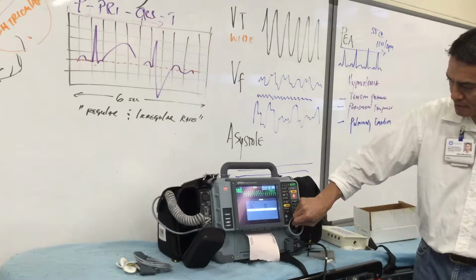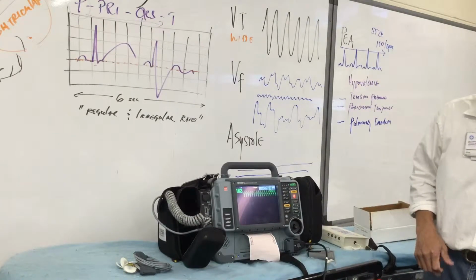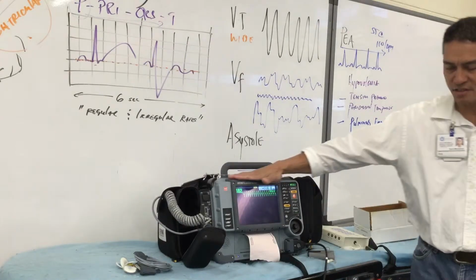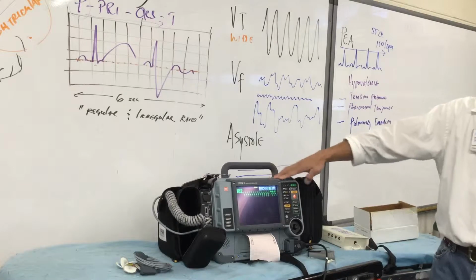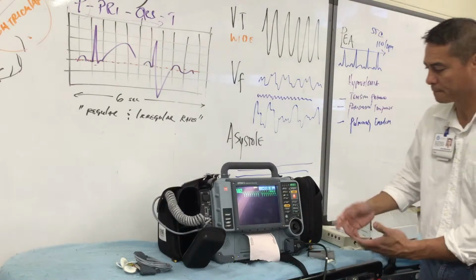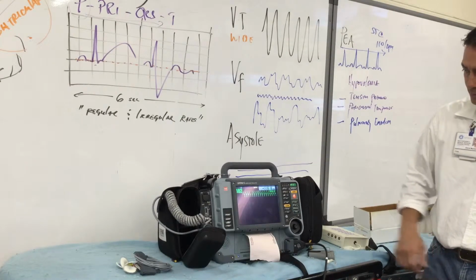We can even allow options to be turned on so that it can tell us that this might be ventricular in origin. So after a certain period of time, it's watching for us. We'll determine that this is a wide complex with no pulse. Person has no breathing. We initiated CPR. We go ahead and place these pads on the victim's chest.